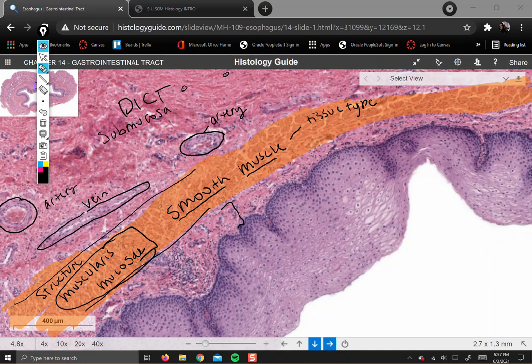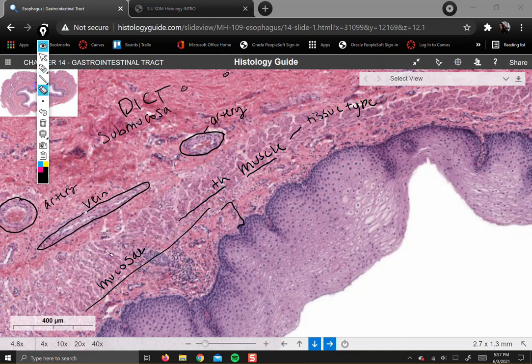All right, so I've located my Muscularis mucosae. I'm going to delete the highlighting for a moment, just so that you can have a little peek at what it looks like when it's not highlighted. And so this is one of the examples of a time where the more examples of a tissue you look at, the easier it will be for you to recognize it, because here we have kind of a mixture of cross-sectional and longitudinally sectioned smooth muscle cells.